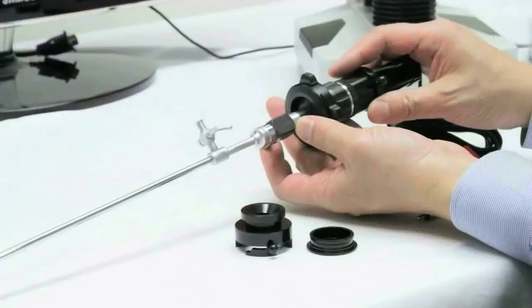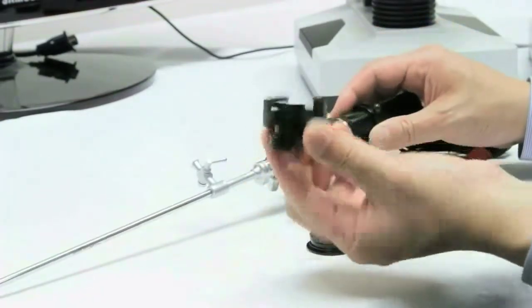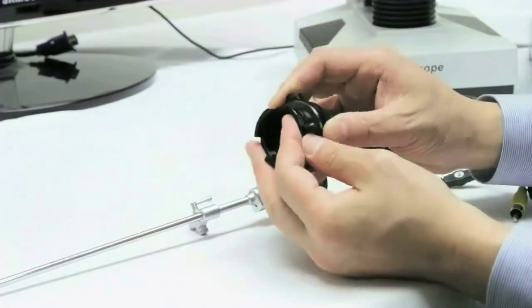To connect the flexible scope, we have an Olympus or Pentax adapter. Simply release the rigid scope, connect the Olympus or Pentax adapter, then connect to the flexible scope.